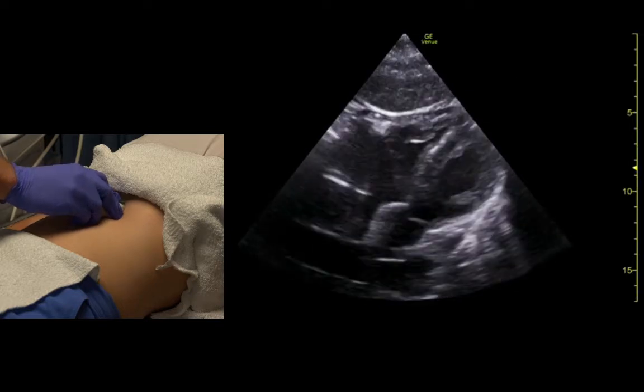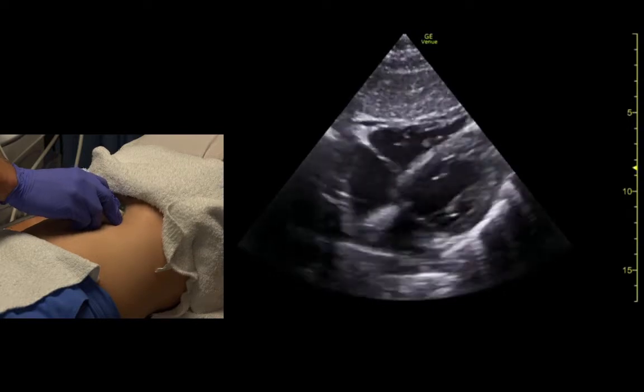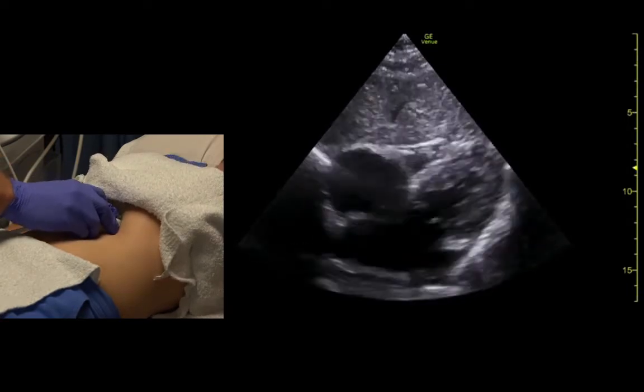Go ahead and relax when you're ready. Sometimes if you flatten the probe, you can see the aortic valve from this view. We can really see the tricuspid well.